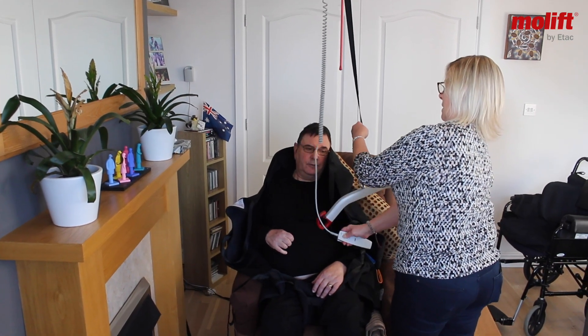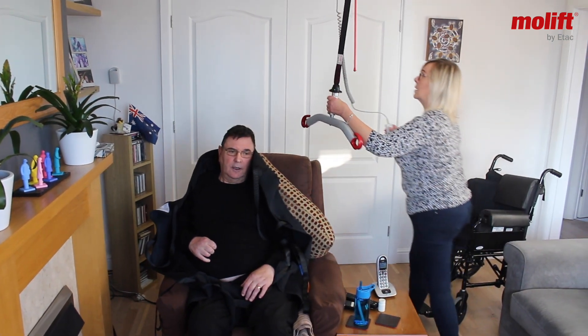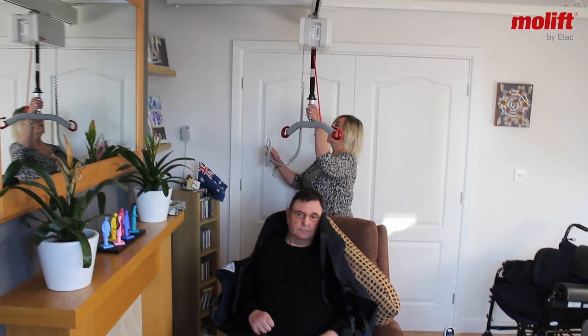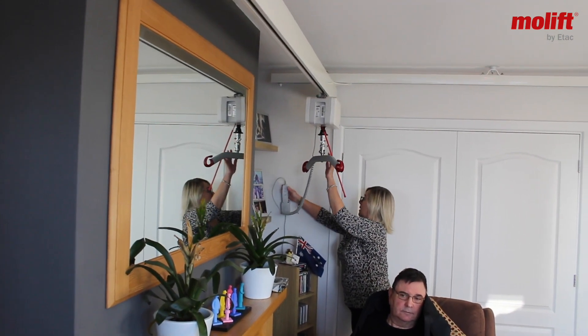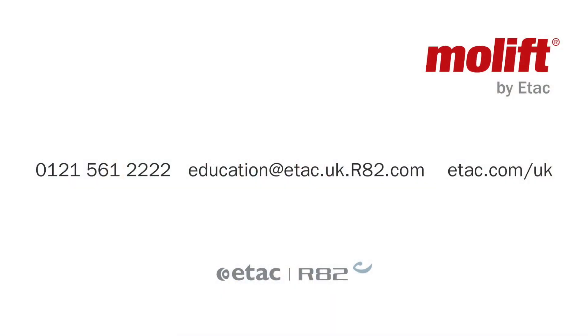And so he then puts the hoist back into the hallway. Thanks, guys.